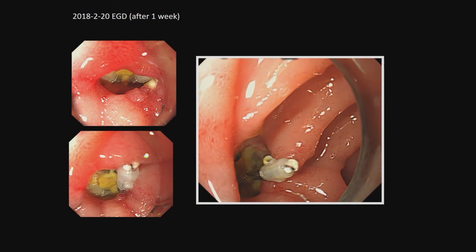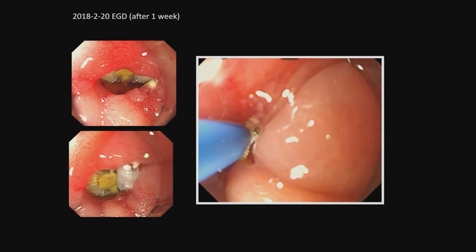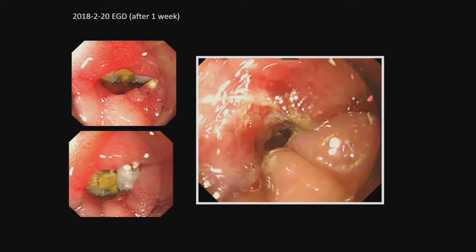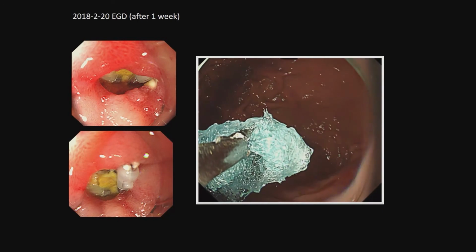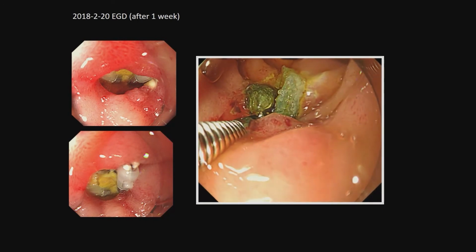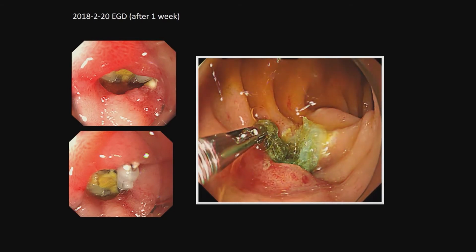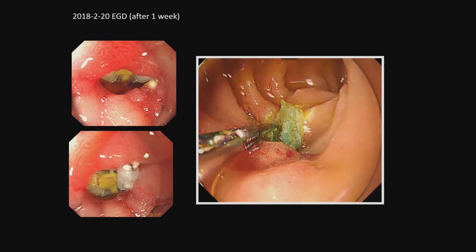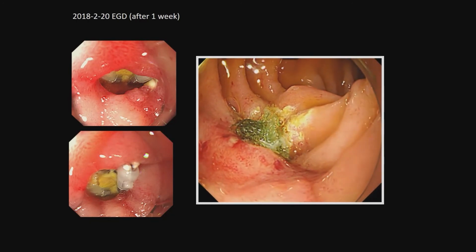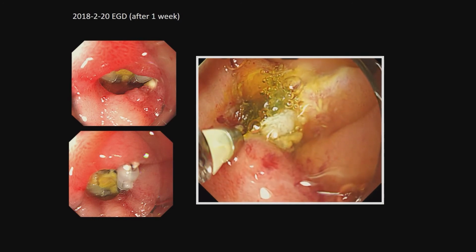So usually the duodenal side is very hard to manage because the wall is very thin, and managing maneuverability of the endoscope is very hard. And the retroperitoneal area also makes it difficult to manage. So I decided to manage this kind of leak site with a PGA.